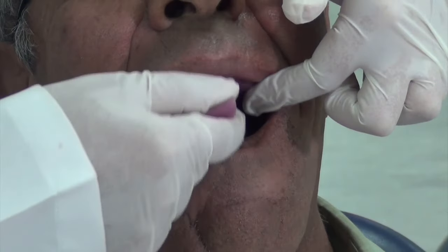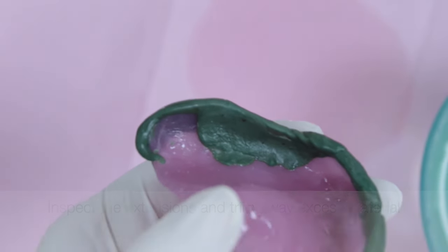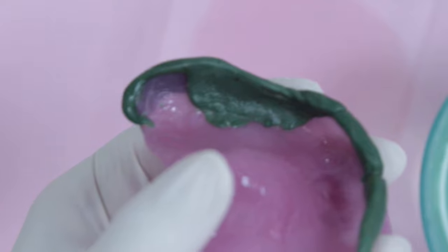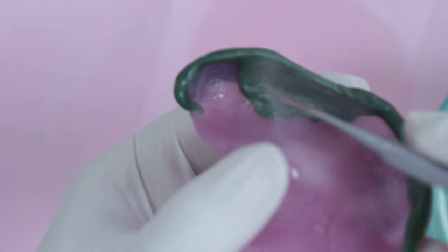Once the material has cooled down, remove it from the patient's mouth gently and inspect it under good lighting conditions. Trim the excess material from the inner borders of the tray and notice how the buccal frenum is border molded and that you have created the coronoid bulge.